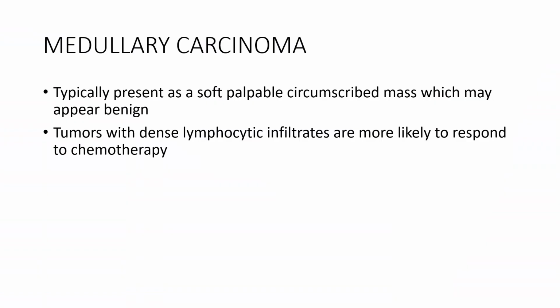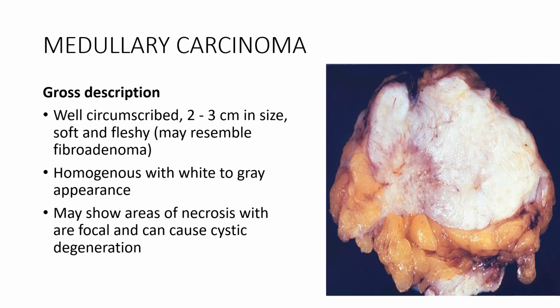Next is medullary carcinoma. These typically present as a soft, palpable circumscribed mass which may appear benign. Tumors with dense lymphocytic infiltrates are more likely to respond to chemotherapy. So one of the prognostic factors with regards to response to chemotherapy is the presence of lymphocytes in the tumor.